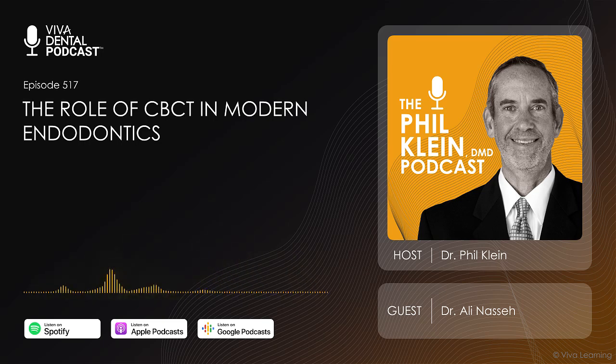And that's another thing, too: CBCT will give you much better information, because there are two main factors you need, Phil, as you know, for resorptive repair decision making. One of them is what I call surgical accessibility, and the second one is the rate of growth. We all look at these images as at a moment in time, but we don't know what the rate of growth is. Right. Oftentimes people make a decision to move on and do something invasively without knowing how fast this thing is growing. Having the two CTs and comparing them together would be very helpful before you decide to do something aggressive. Yeah, recording those images over time using CBCT, absolutely, over a period of time.